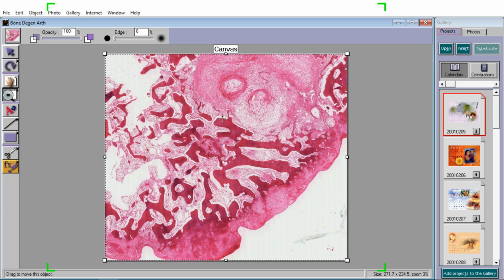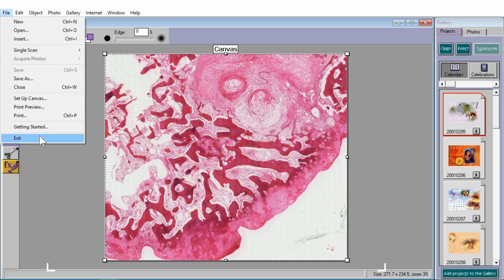In fact, in this case, you also have something, and I'm not going to go into this, but you can see there's also such significant thinning of the joint space here and pressure upon the bone that in this area a little cyst has formed because of loss of bone completely. This is a classical picture of a degenerative disease process. We've showed you some classical examples of acute inflammatory diseases. We showed you some examples of autoimmune disease as an inflammatory process. And now we showed you a classical picture of a degenerative process involving the joint.